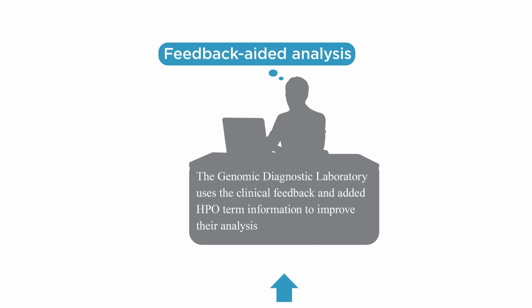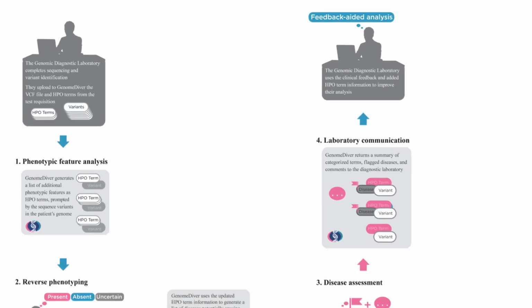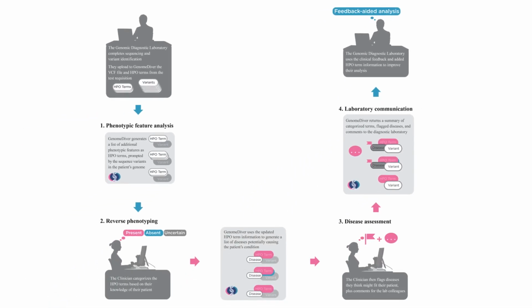The diagnostic lab colleagues now have an enhanced description of the patient's phenotype and the clinician's insights to help them to understand the patient's genomic sequence variants. Our goal is to engage the clinician for no more than several minutes so that we can increase our diagnostic yield from genomic information, enhancing clinical care.